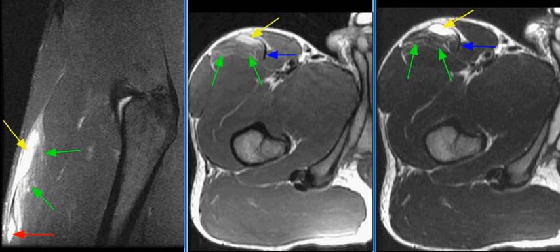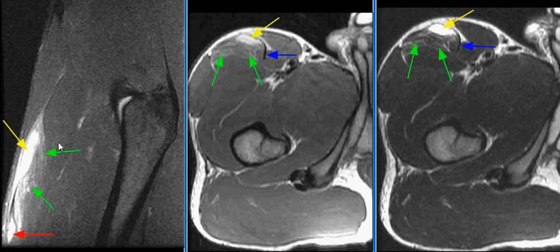A 25-year-old male presenting with right hip and thigh pain. An MRI exam of the right thigh was performed. There is T2 hyperintense edema in the anterior aspect of the rectus femoris muscle, compatible with a grade 2 strain.